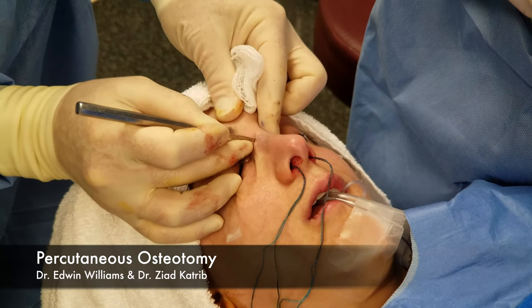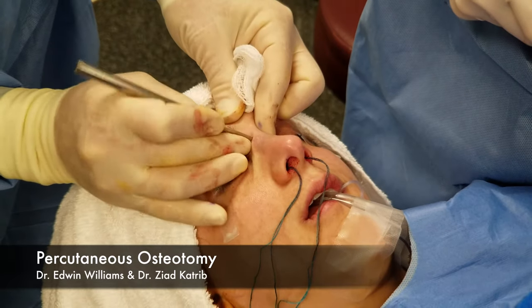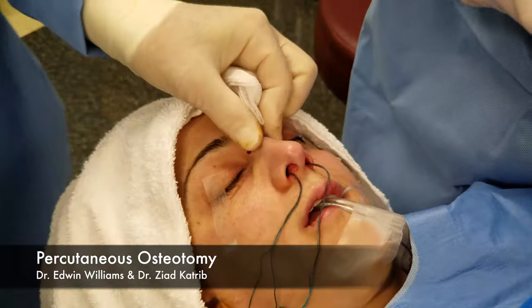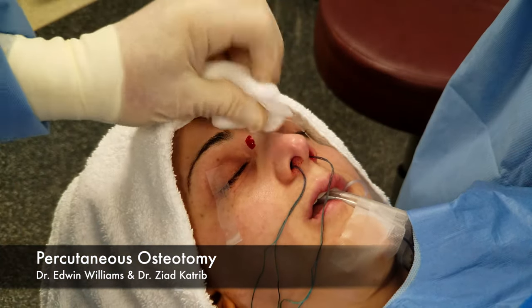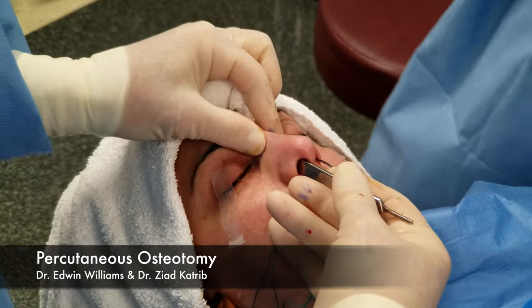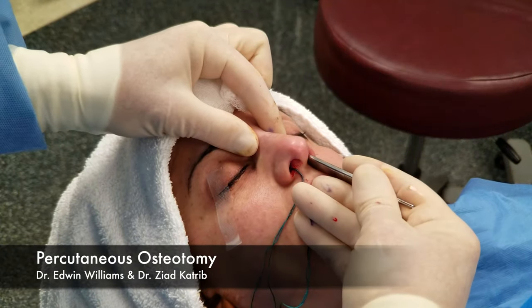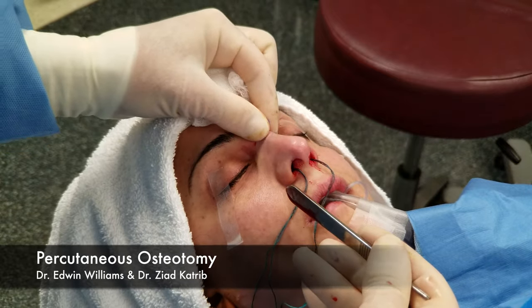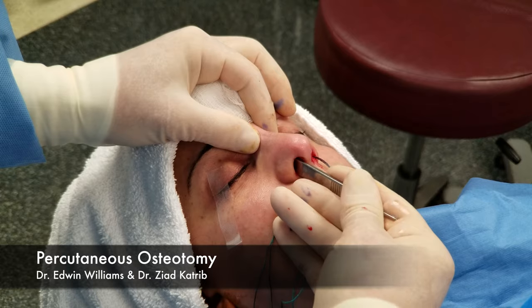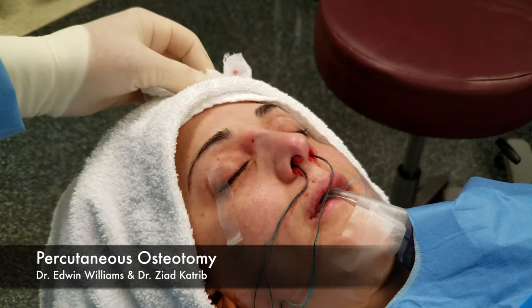I do these with one good tap. I'll check there, and then one right here — one good tap — and I think that's probably going to do it. Sure enough, that mobilized the bone. It's a nice little finishing touch when things aren't just right and you know there's something in the osteotomy area holding it. It's very atraumatic, easy to do, and you don't even need a suture.